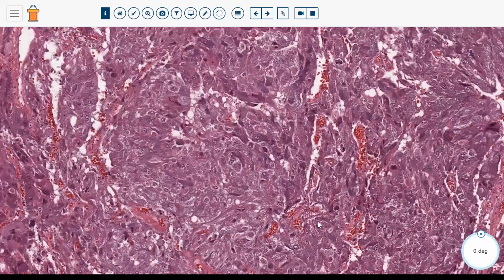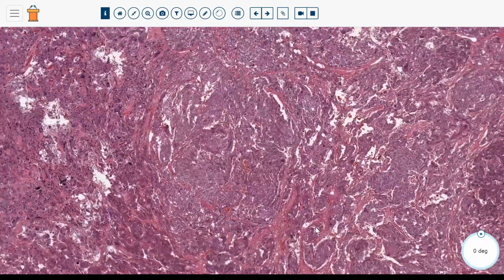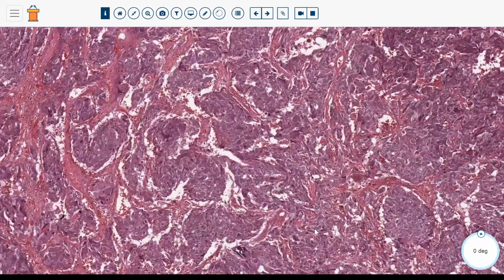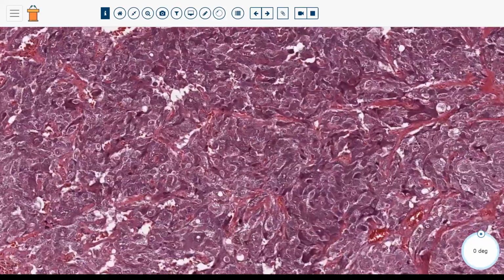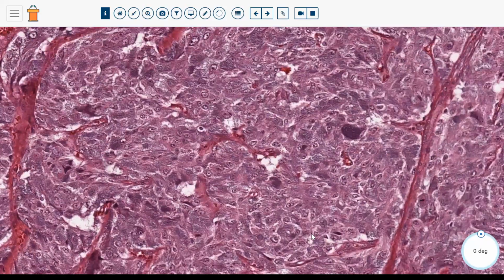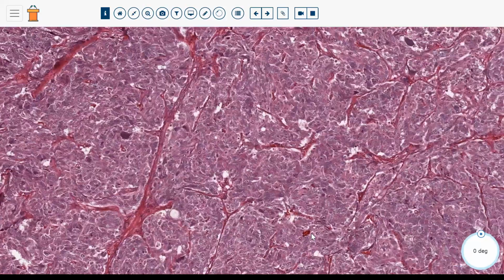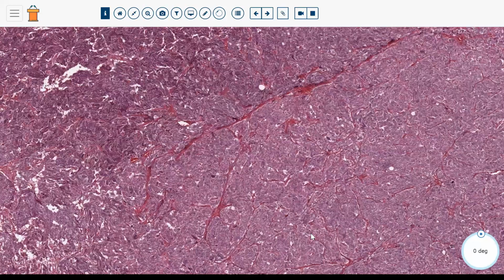So I think this is a pretty good example of a pheochromocytoma. It has these patchy areas of substantial atypia. If you were trying to use one of these scoring systems, I think this would qualify for atypia. But at least my current stance on this, and what I've gathered from speaking to endocrine experts, is that there's really not a requirement to do any of these scoring systems right now, as they've not been proven to predict the malignant behavior of pheochromocytoma very well.